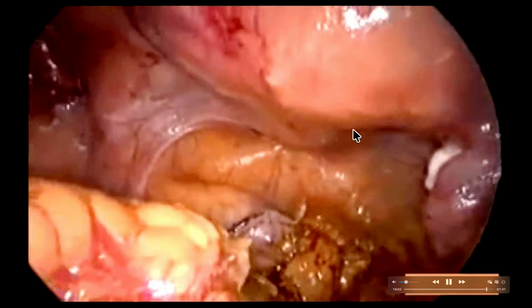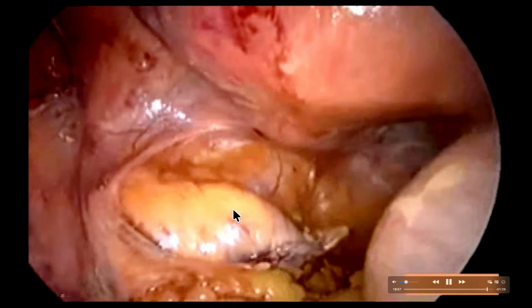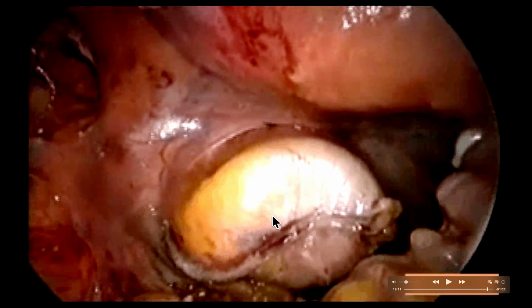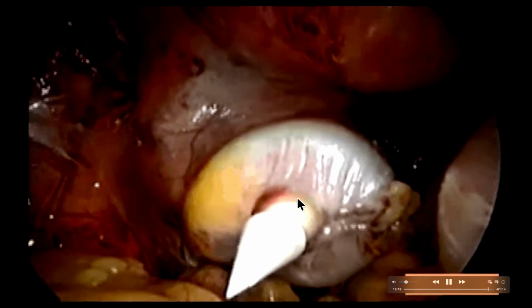After that, what is this? Uterus. This is what? Ovary. This is what? Tube. And here is the rectum. Now the assistant surgeon is pushing the perforator through the rectum by the side of this staple line. If it is pushed over the staple line, all the staples open. Just like in your shirt, where the stitch is there, if one stitch is open, all will open. So you have to perforate by the side of this staple line here. And this is perforating the rectum.